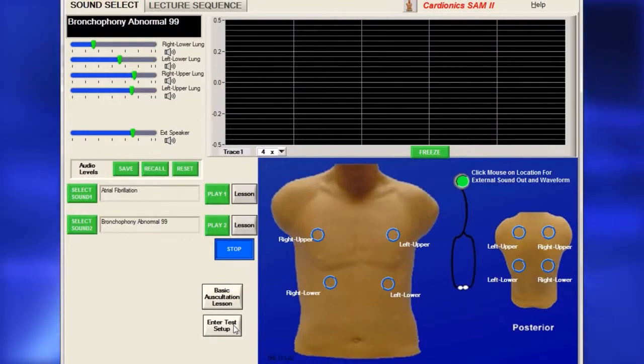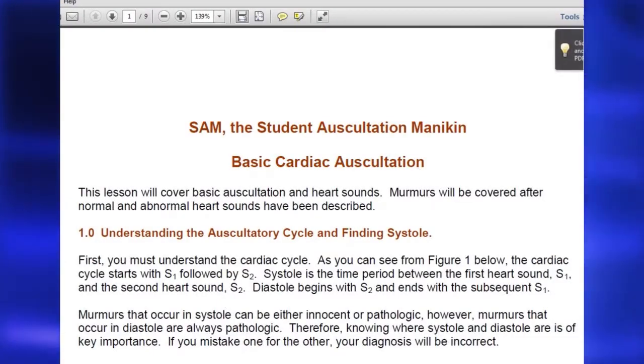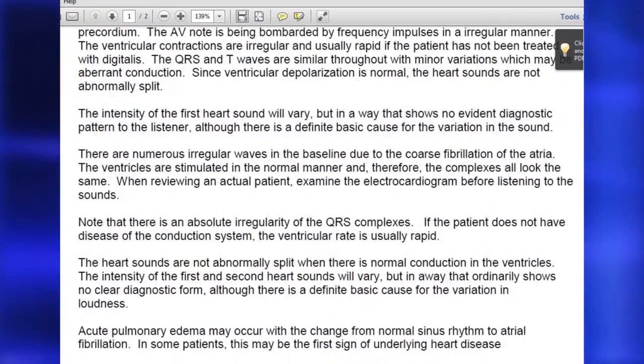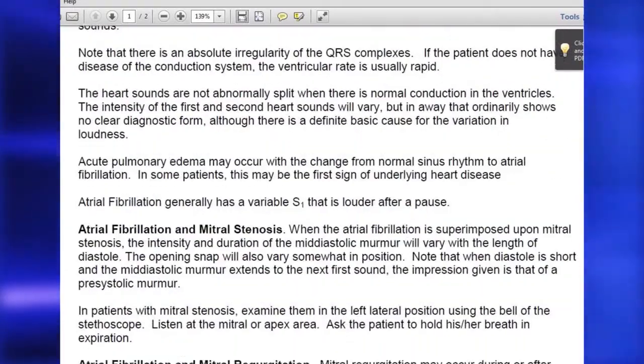SAM2 includes a lesson for every sound, accessed by clicking on the Lesson button. Each lesson has a description of the sound.